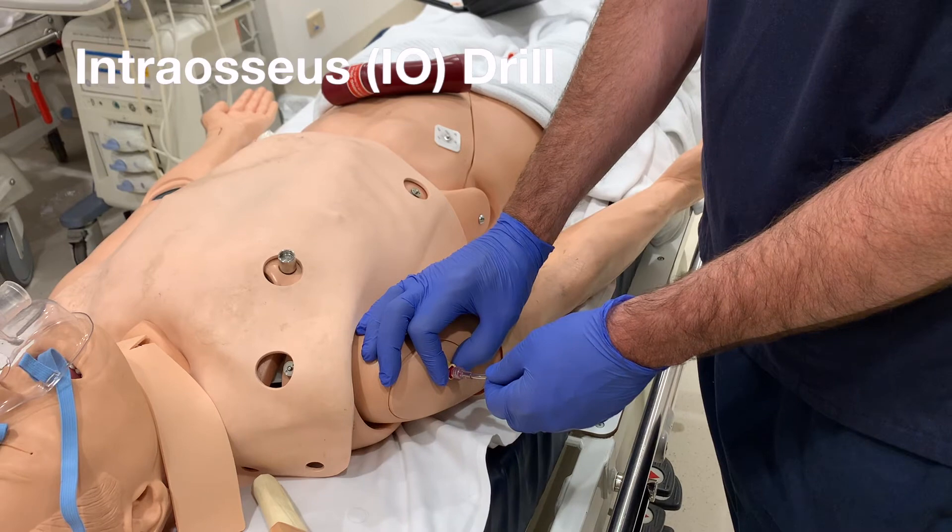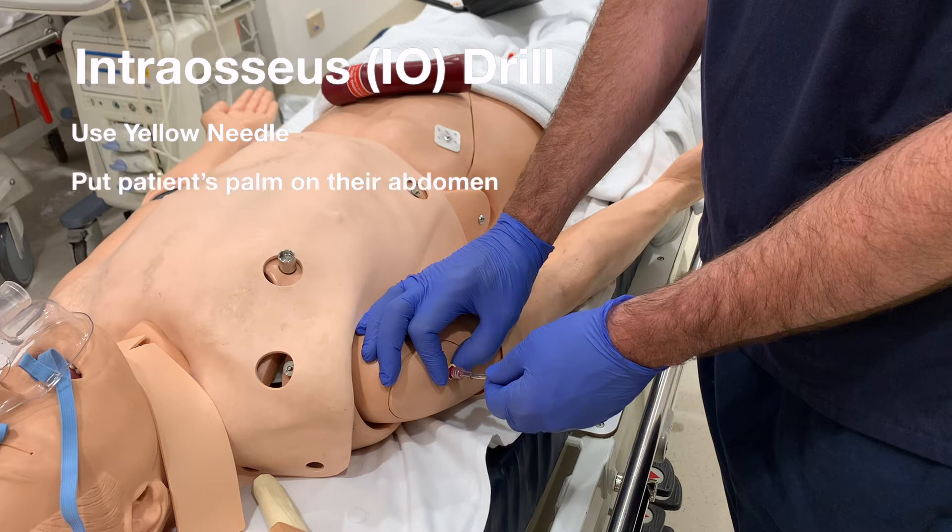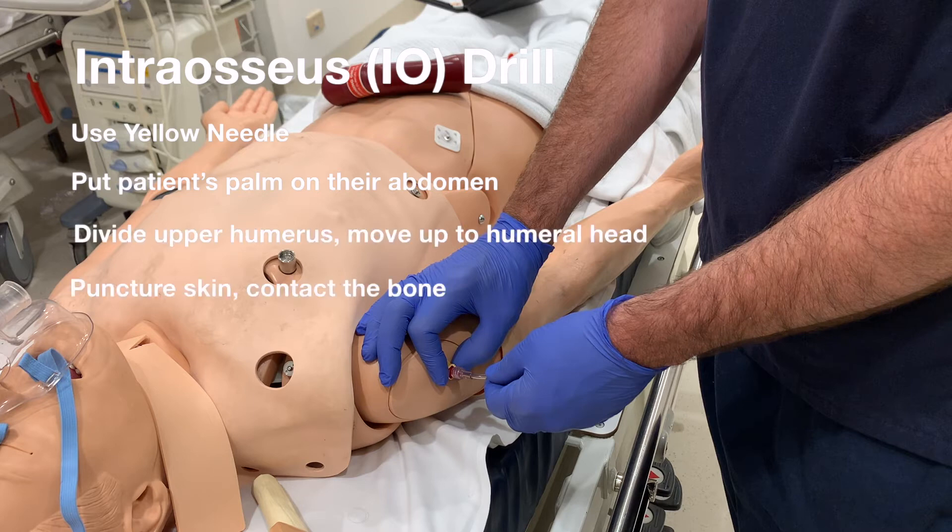So to summarize intraosseous insertion: use a yellow needle, put the patient's palm on their abdomen, divide the upper humerus in halves, meet your thumbs in the middle and move up to feel the humeral head. Insert the drill by puncturing the skin first, then contacting the bone, then press the trigger and drill into the medulla. Connect the IV tubing, secure and hold the line.